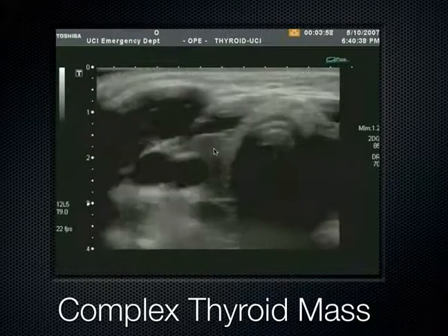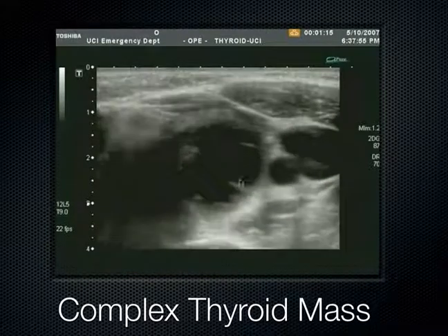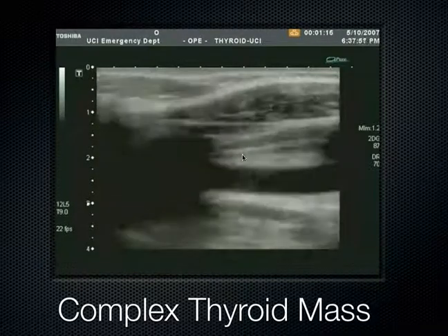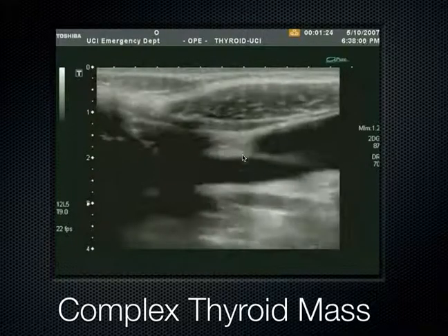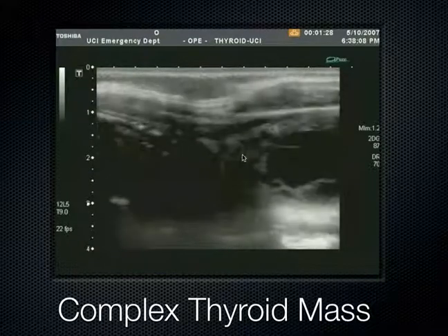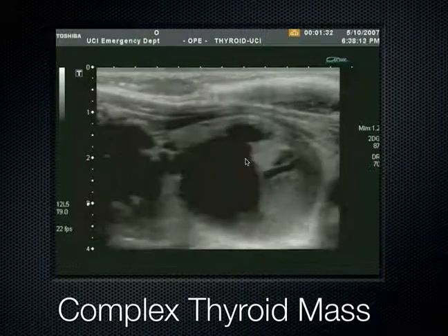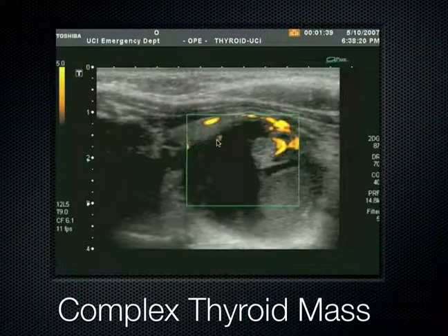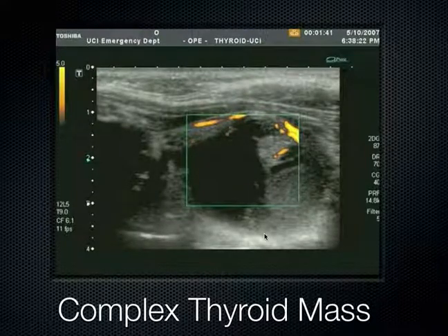The carotid is right next to the thyroid — this is the left neck over here. We can see it's got multiple cystic structures. We did a fine needle aspiration on this patient and it came back benign, just showing you the way that these complex thyroid masses can present.